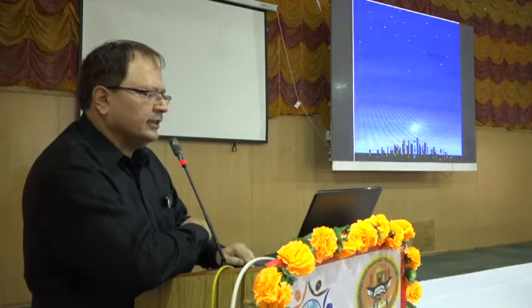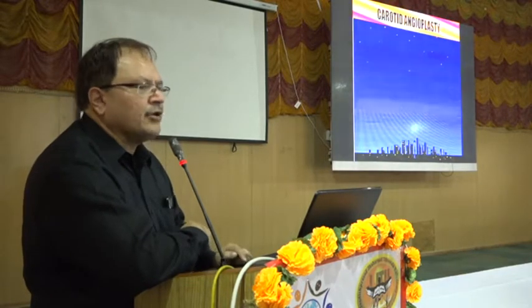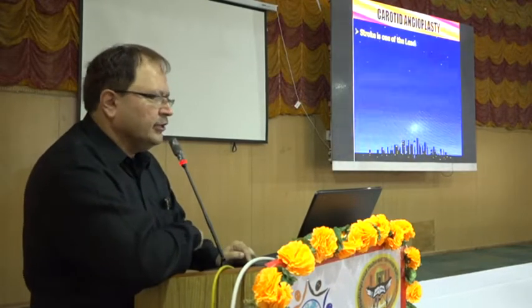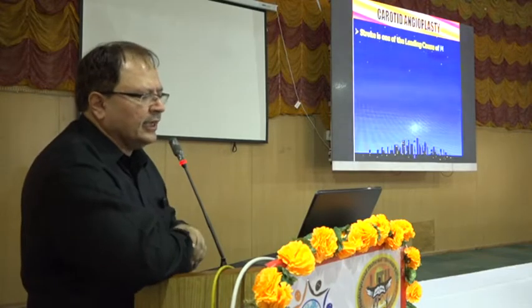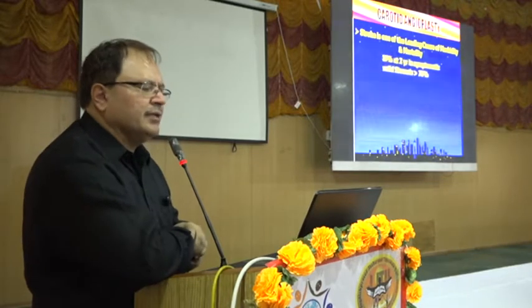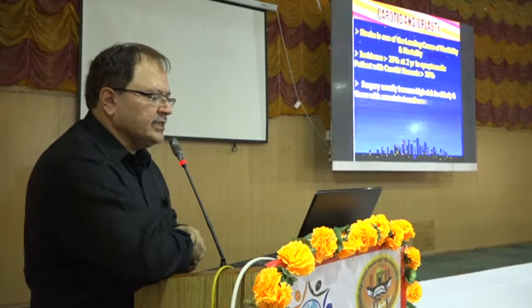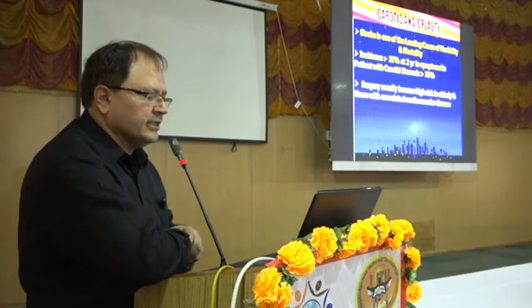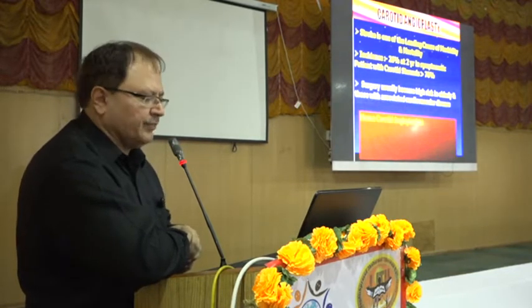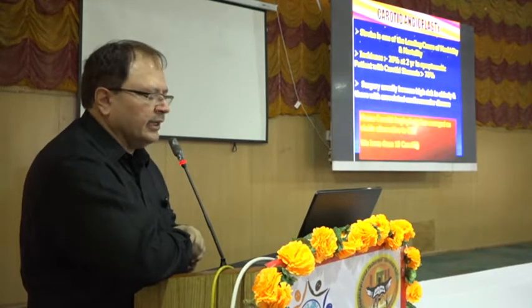The most important now is carotid angioplasty. Carotid angioplasty is very, very important, and we have developed new equipment for the angioplasty, which has made it very, very safe. As you know, stroke is one of the leading causes of morbidity and mortality. The incidence is 26%. The indication is if the patient is symptomatic and the lesion is more than 70%. Surgery usually becomes high risk in the elderly and those with associated cardiovascular diseases. Hence, carotid angioplasty has emerged as a viable alternative to carotid endarterectomy.